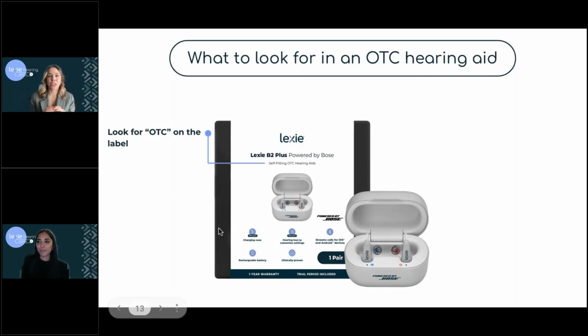Okay. First, you want to make sure that OTC, which stands for over the counter, appears somewhere on the packaging. Okay. This means that it adheres to the new FDA standard for this category. Then you're going to want to look for a return policy.